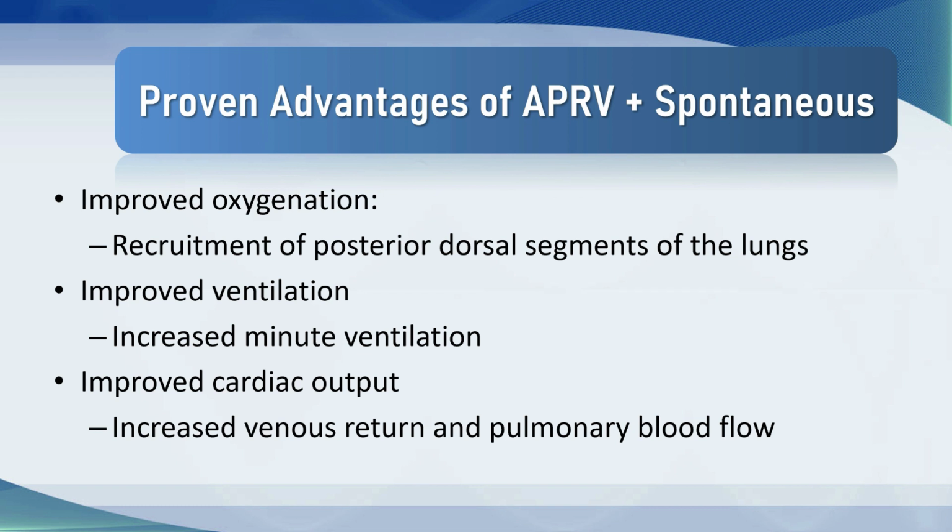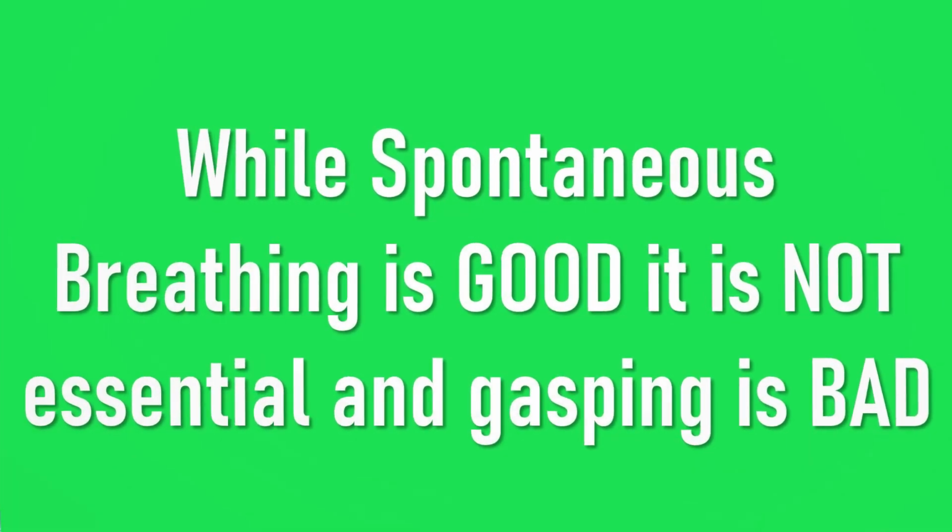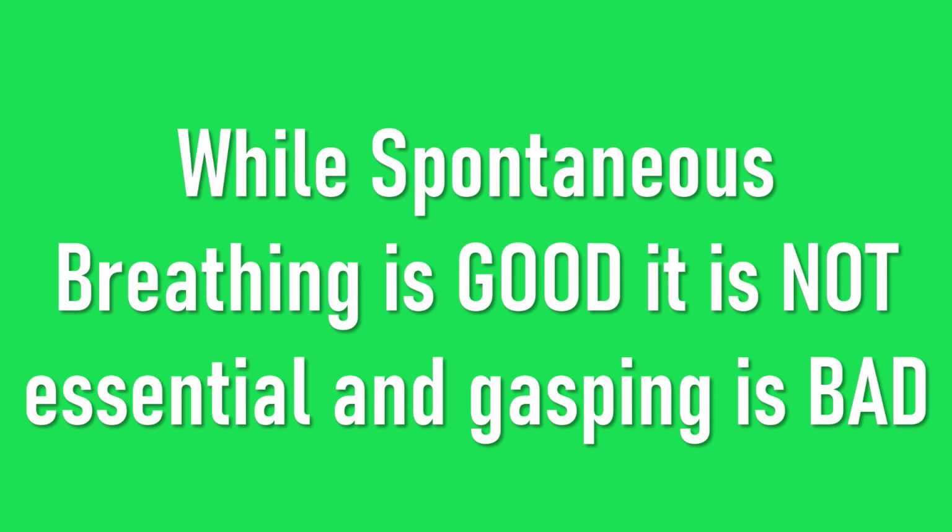So these are all good things. But remember, this is a patient getting an extreme mode of ventilation. It's not for everybody. It's for patients with severe hypoxic respiratory failure and low lung compliance. And I will make the point that while spontaneous breathing is good, it is not essential, and gasping is bad.